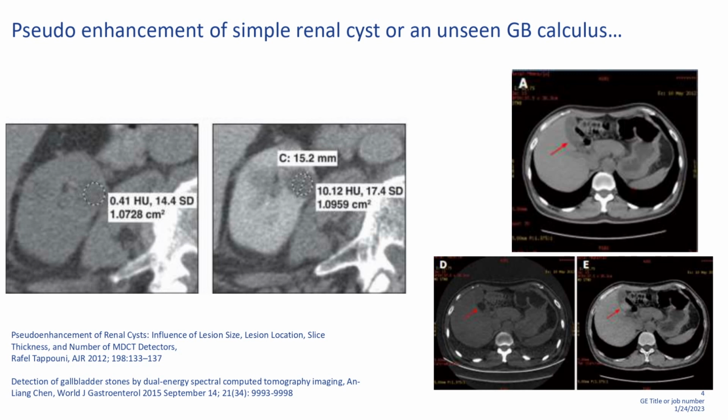The moment you go for something called monochromatic or material images, you will be able to see it. This is the reason why we have now moved from a normal CT to a spectral image. You see, in the spectral image, you are able to see the cholesterol calculus. Why? Because we are going for material based images. So measuring true Hounsfield unit and going to material will help you to be specific on the lesion, specific on the object which you are looking at. That's the basic reason why we have introduced dual energy CT.